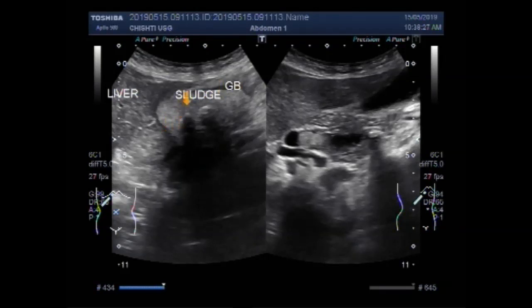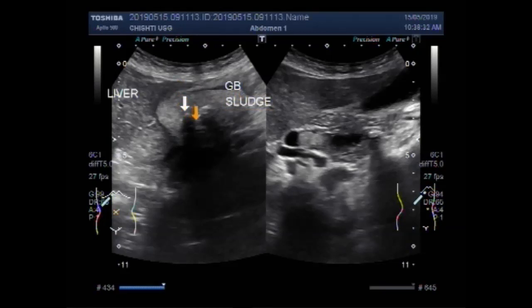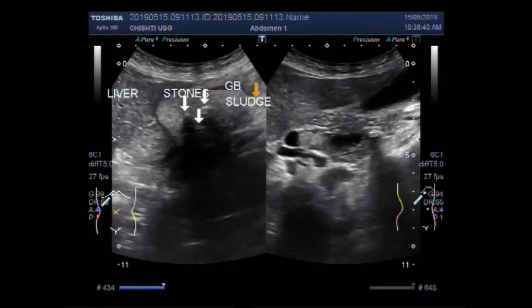These are the stones seen in the gallbladder sludge. This one is the stone in the gallbladder, and this is the sludge seen in the gallbladder.